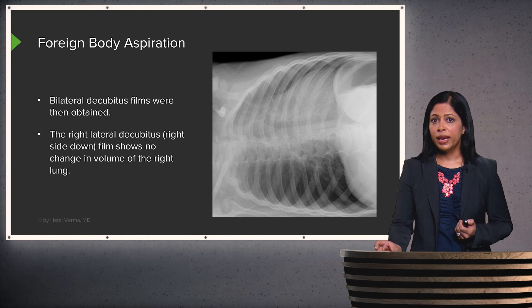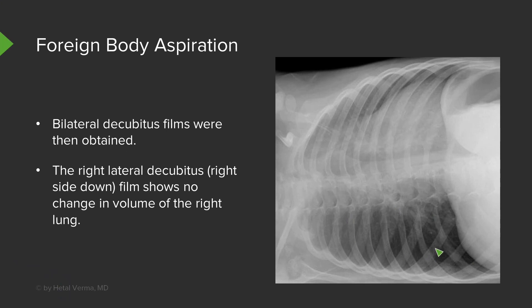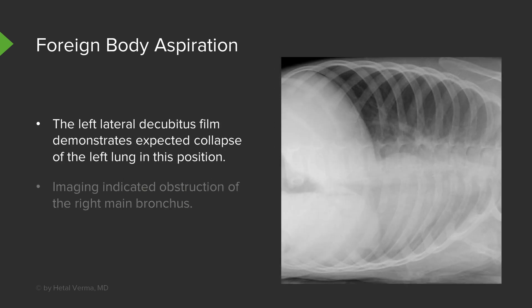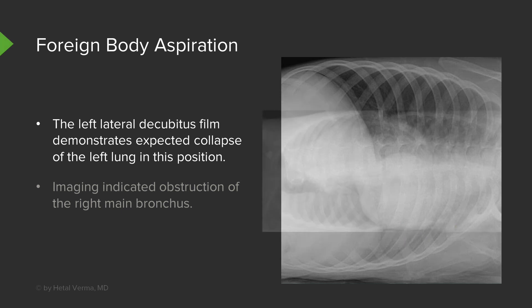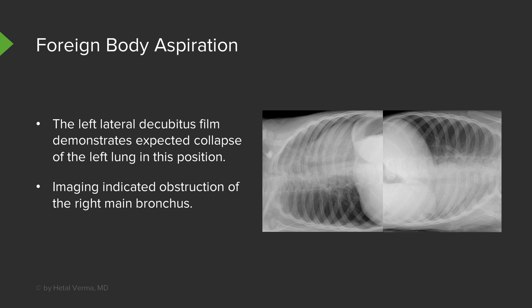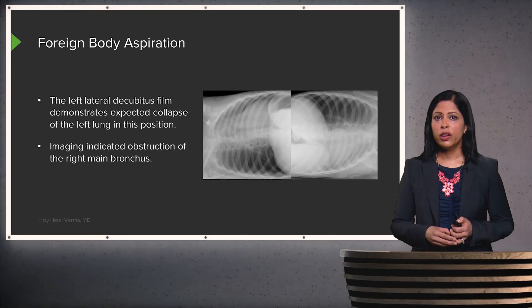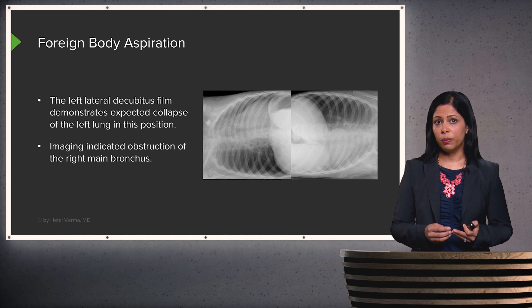The right lateral decubitus film shows no change in volume of the right lung. Generally, because of gravity, the lung in the lower position should decompress, and if it remains persistently hyperinflated, that's the side of the abnormality. The left decubitus film demonstrates normal collapse of the left lung — as expected, the lung in the lower position collapses due to gravity. This imaging indicates obstruction of the right main stem bronchus with a foreign body, and the patient underwent bronchoscopy to remove it. These are some common abnormalities encountered in the neonatal period and in children — very different from what you'd encounter in an adult.